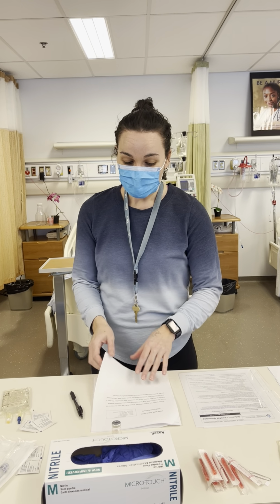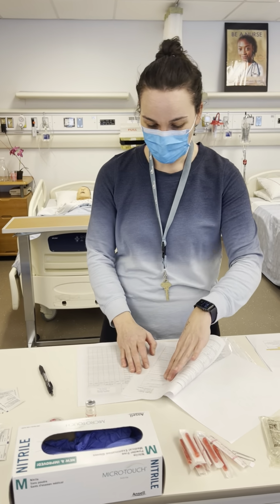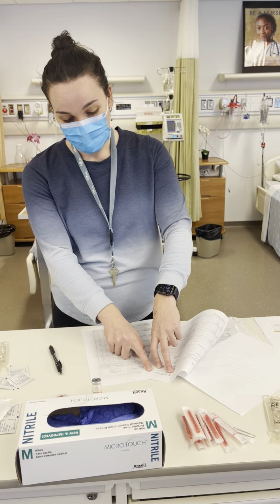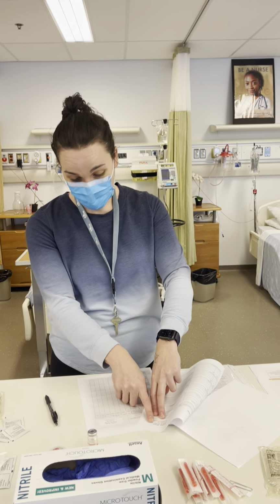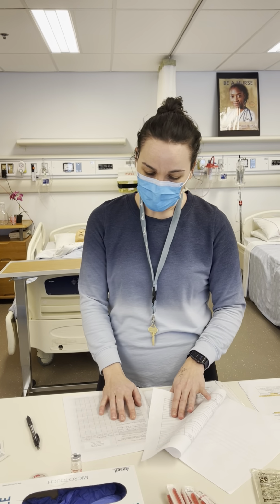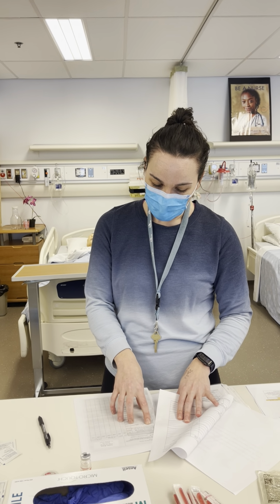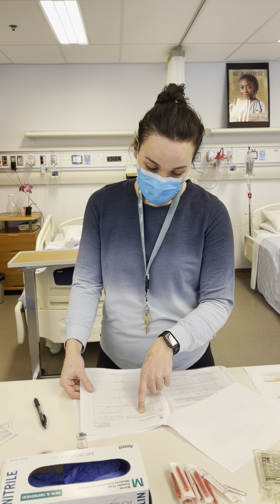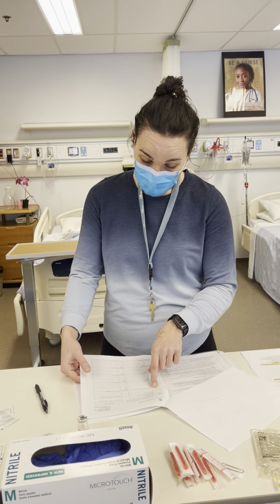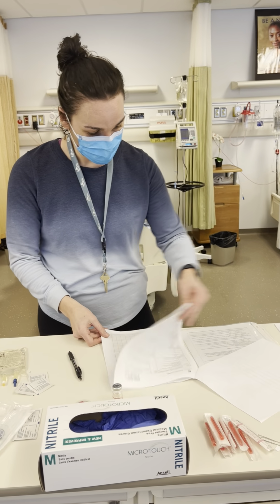Okay, so the first thing we're going to do is look at our physician's order and compare it to our MAR. So we'll compare the name, Bryson Scotland, compare FIN numbers, 1, 2, 3, 4, 5, 6, 7, 8, 9, that matches. And then we're going to compare the medication order. So we've got insulin, Humulin R, continuous IV at 2 units per hour. Humulin R, continuous IV, 2 units per hour. So that matches up. We're signed here, so everything's good.